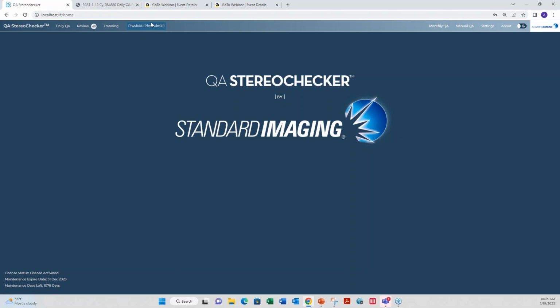Before I go into those, I just also want to point out this blue box, which shows you who I'm logged into the system right now. If you have the case where the therapist has run QA and everything is passed and you pass through and they're like, hey, why don't you just sign off on this since everything's good to go? This is the box you would click on to change the login in order for an authorized physicist or a physicist administrator to be able to sign off on that daily QA.